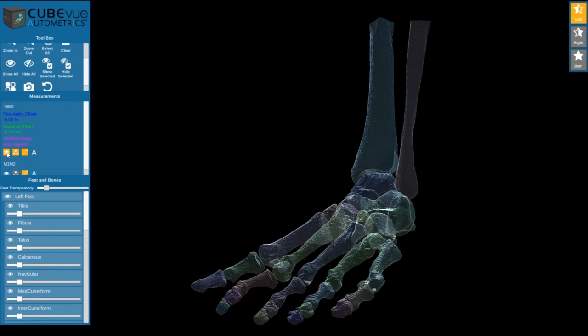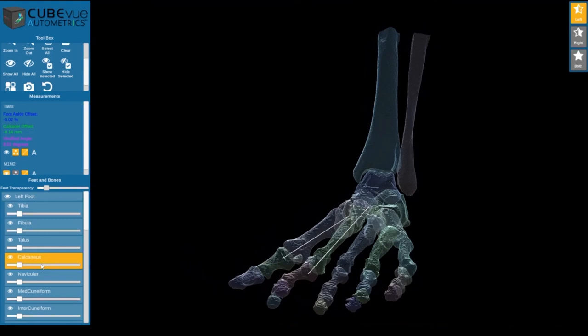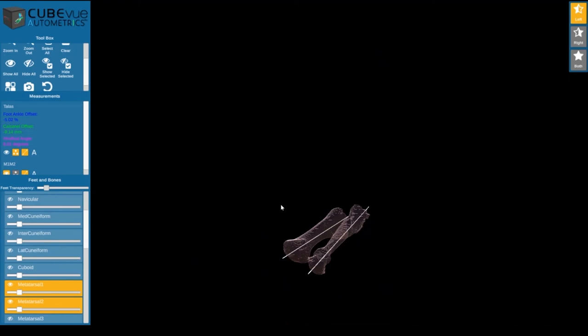A common angle that's measured when it comes to foot and ankle conditions is the inter-metatarsal angle between the first and second metatarsal. Here you can easily see this measurement and evaluate it in 3D.